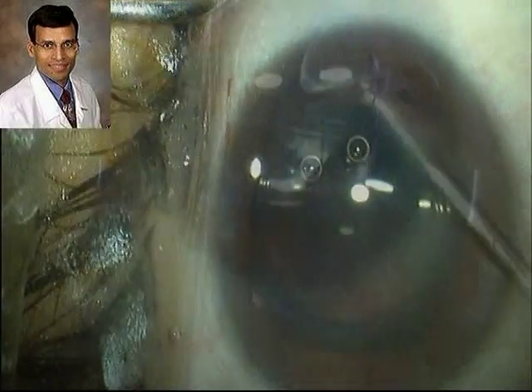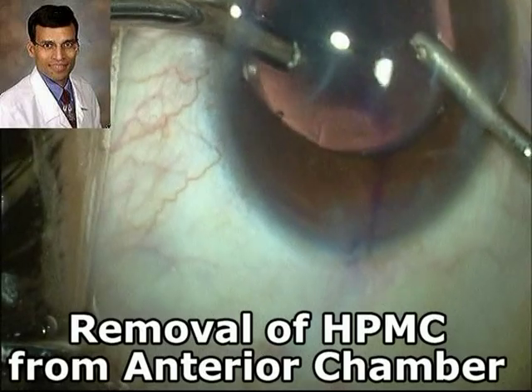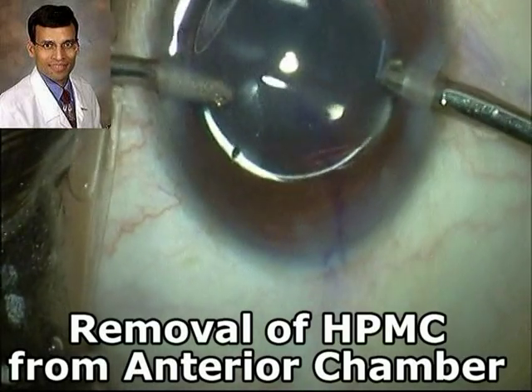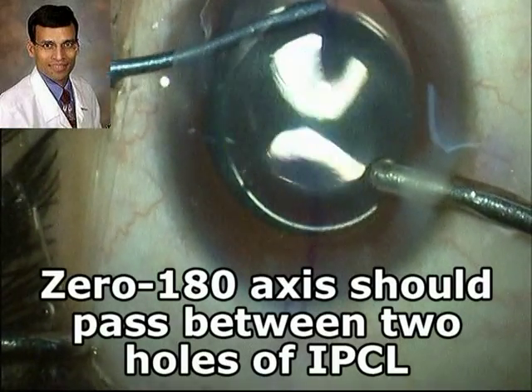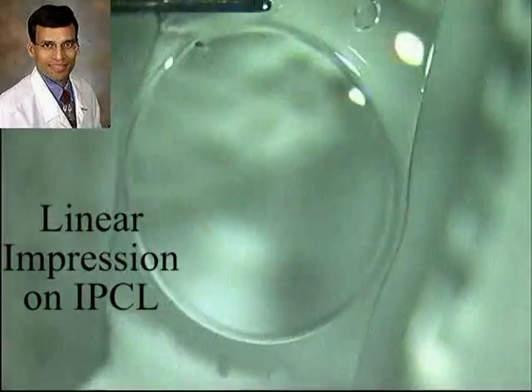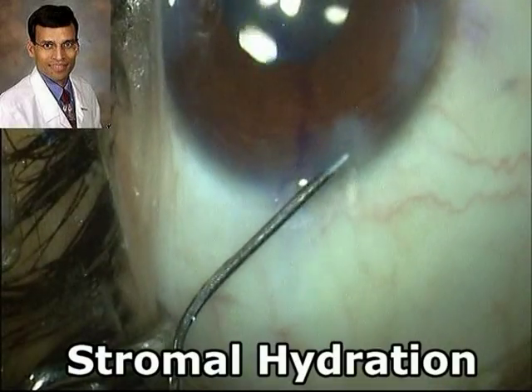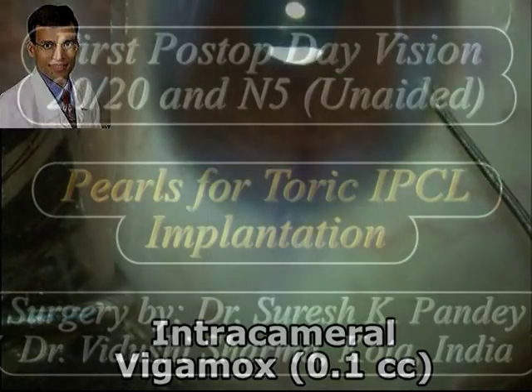Once the IPCL has been properly positioned, we remove the HPMC from the anterior chamber using irrigation-aspiration instruments. Just like for toric IOLs, after removing all the viscoelastic, we again ensure proper alignment of the axis of the toric IPCL. Note that this was the first model of the toric IPCL from the Care Group and does not have the linear impression marks now available in all their toric IPCLs to aid axis alignment. The incisions are then hydrated in the normal fashion, and as is our routine, we inject intracameral moxifloxacin into the anterior chamber at the end of surgery.